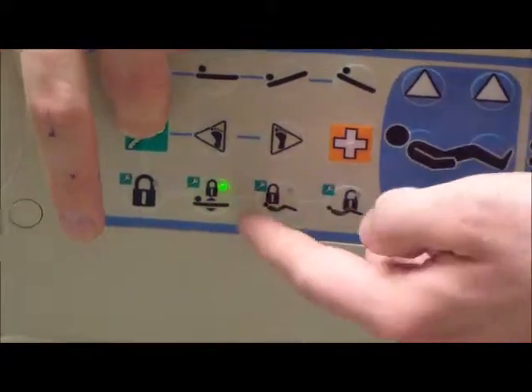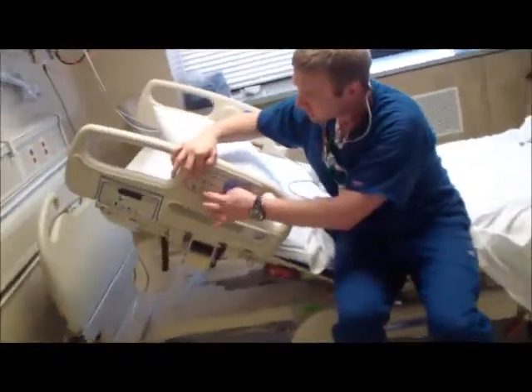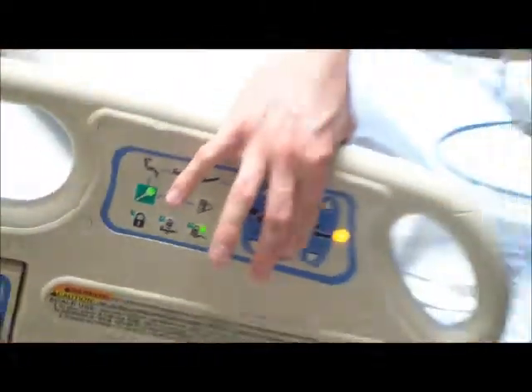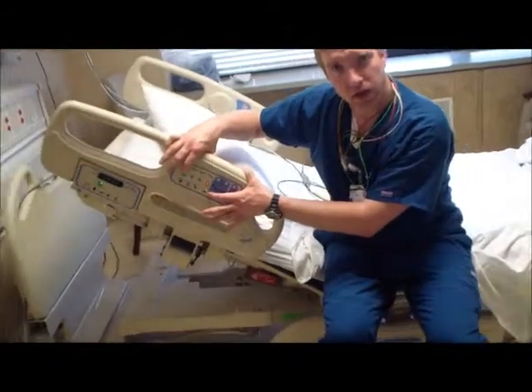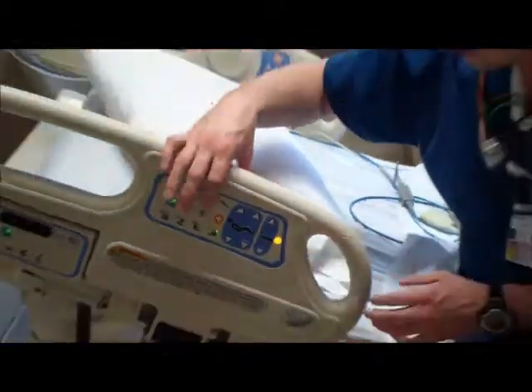This one modifies the height of the bed, so right here, we're stuck with this height of the bed. And these, if you activate them both, don't allow you to modify the height or position of the knee area. So this button right here, if you activate with the green indicator and make sure it's lit up as well, locks both flexion and extension for the knee.